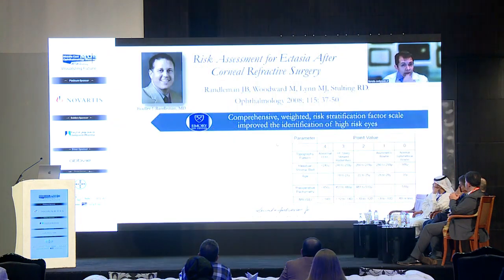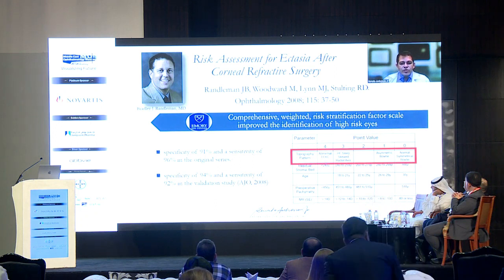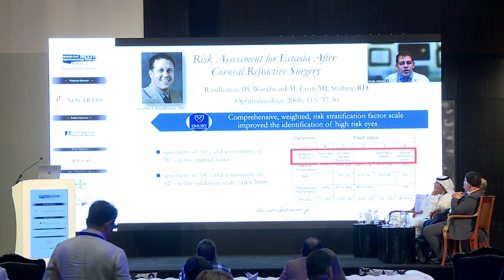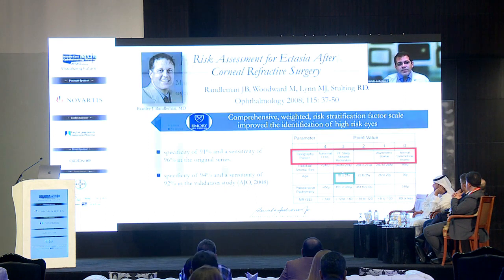Interestingly, when you think about ectasia risk assessment, we have the ectasia risk assessment by Randleman and colleagues in 2008, showing that the topographic pattern is very important for understanding ectasia risk. But my major concern is that forme fruste keratoconus should not be a topometric pattern and should not be an abnormal topometric pattern. Moreover, we'll discuss the definition of forme fruste keratoconus. But in this very nice work, we had age, which is a surrogate of corneal biomechanics, coming as a very important factor for ectasia risk assessment.